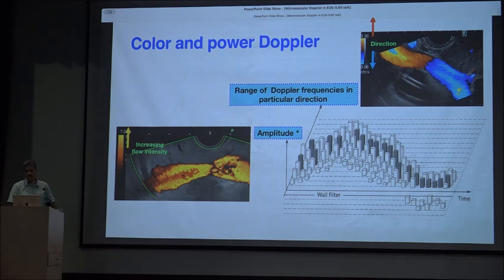When we talk of power Doppler, this takes care of only one dimension of the Doppler spectrum. And here we are depicting the amplitude. So this tells us nothing about what direction the blood is flowing or what is the velocity of the blood which is flowing. It only tells you how much, at that point, the amplitude or the intensity of the returning Doppler signal. Higher the intensity, it's a monochromatic scale, the lighter the shades. The basis of power Doppler.